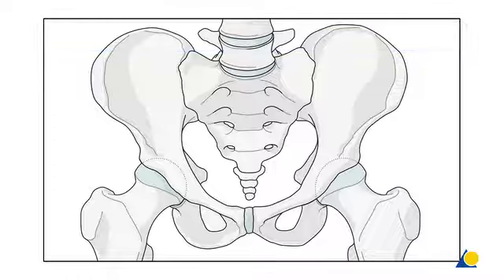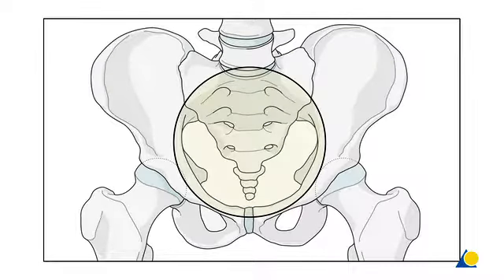Access. This is a percutaneous technique, so access is determined by C-arm visualization. The preoperative X-rays and CT scan are reviewed to determine the size of the upper sacral segment corridor and if the sacrum is dysmorphic.